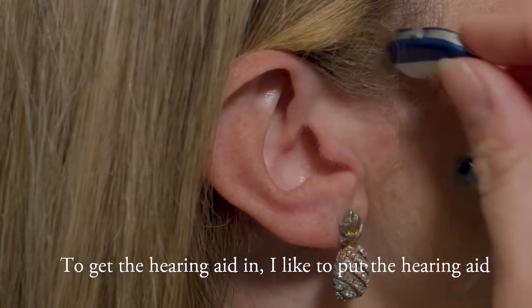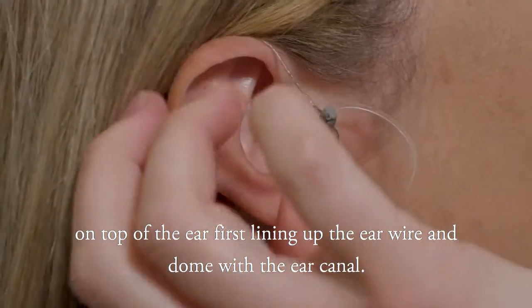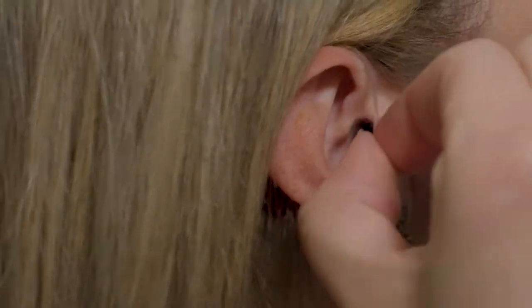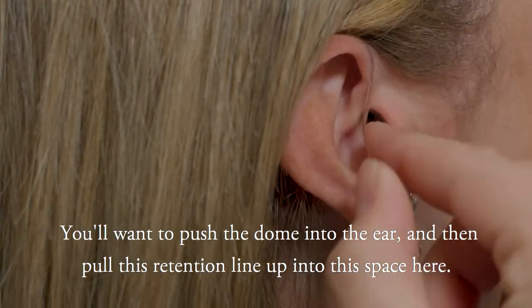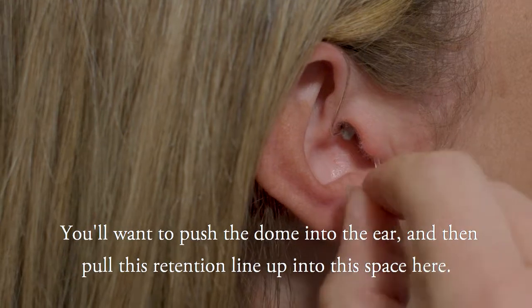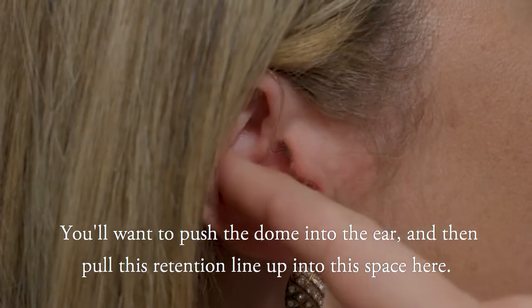To get the hearing aid in, I like to put the hearing aid on top of the ear first, lining up the ear wire and dome with the ear canal. You'll want to push the dome into the ear, and then pull this retention line up into this space here.